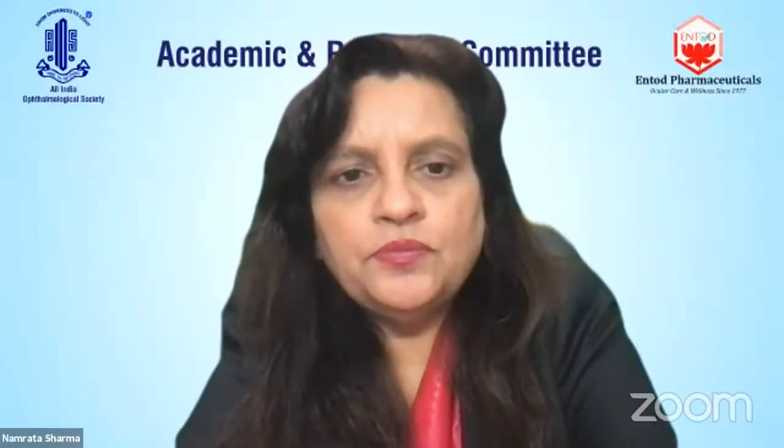Can I add one thing, Chitra? We looked at the complications of phaco in our residents, and the majority of the complications were related to small pupil. So the small pupil is a very major problem, in my opinion. I think the small pupil has to be tackled.